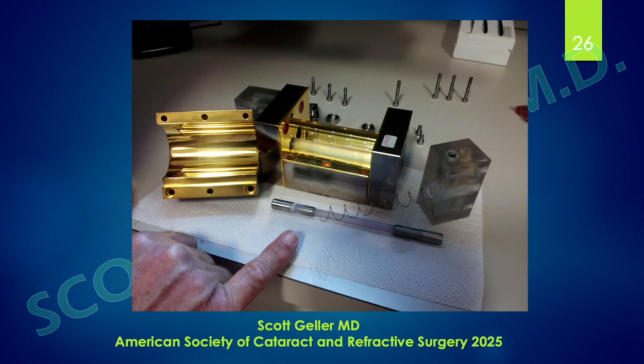This is the laser cavity, gold-plated, so there's no corrosion. The YAG crystal is that thing being pointed to by one of our laser experts from Switzerland who comes over to service my unit. The housing is water-cooled, which gives it much greater capability versus a diode-pumped laser, which are very common in ophthalmology. Most of the lasers are, as we call them, diode-pumped.